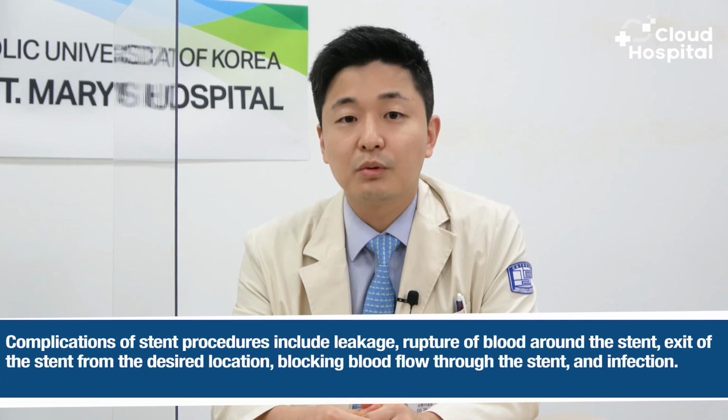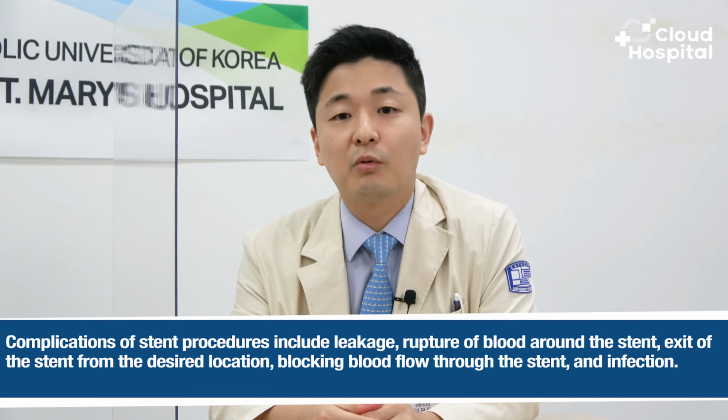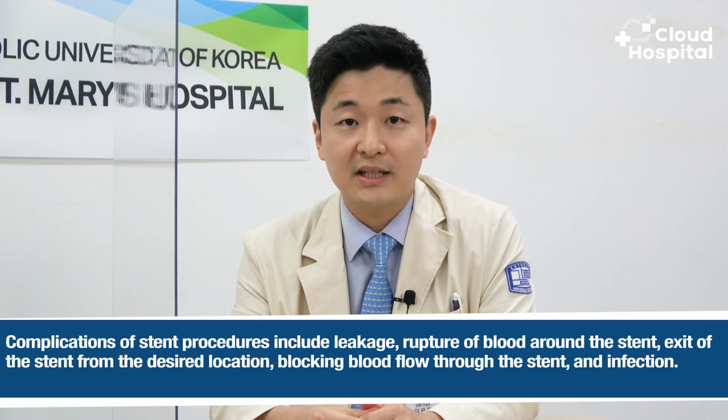Are there any risks to this kind of stent? Complications of stent procedures include leakage or rupture of blood around the stent, exit of the stent from the desired location, blocking blood flow through the stent, and infection.